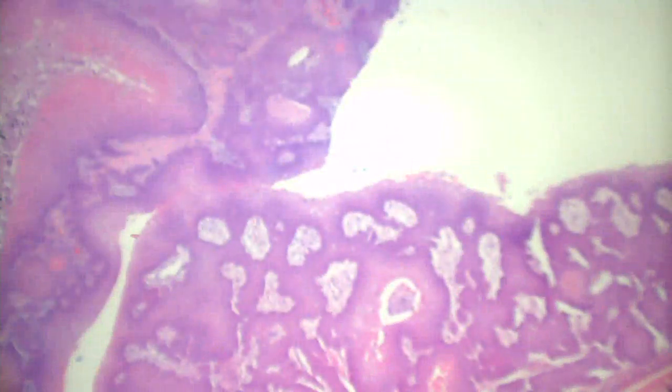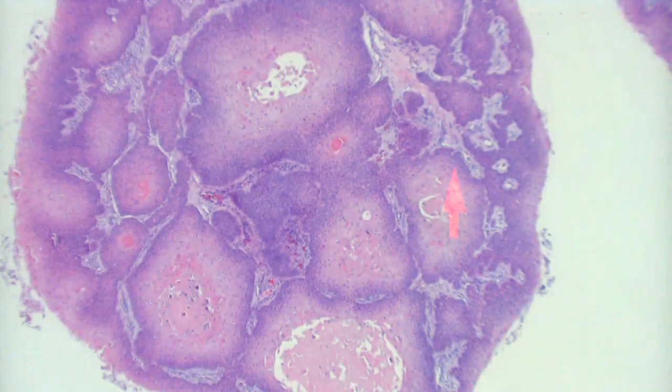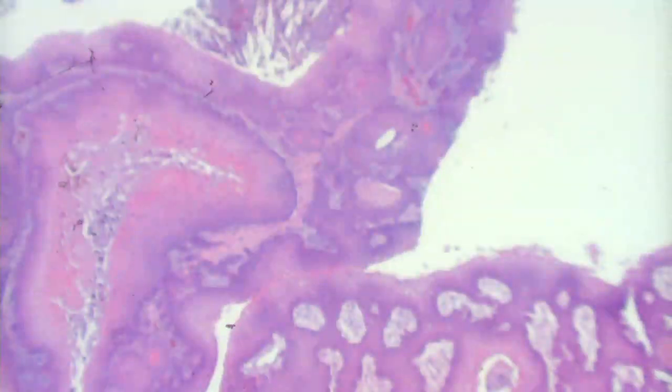Now, these can sometimes undergo malignant degeneration. Pretty rare, but they can. So if you look through one of these and see an area with lots of atypia, where one of those little aggregations is asymmetrical with a lot of mitotic figures, it may be degenerating into a cancer. So we know that these adnexal neoplasms can sometimes gradually turn cancerous. Rare, but they can, so you want to follow these patients. They don't always have to be re-excised, but if you don't remove it and it stays there forever, it can eventually turn into cancer in some cases.